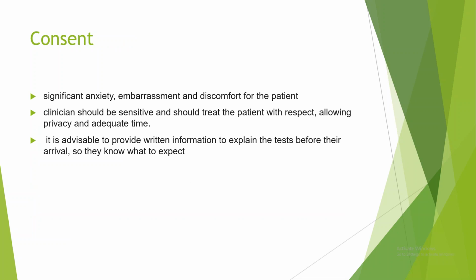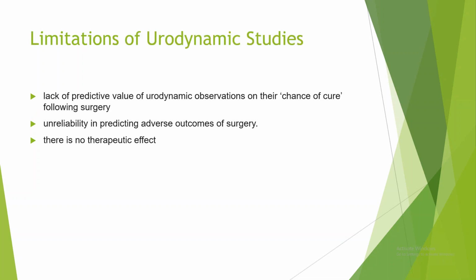Now in consent, the consent should be written. Actually, this urodynamic study causes very much embarrassment to the patient, and also it causes significant anxiety and discomfort for the patient. So for that matter, the clinician should be very sensitive and should treat the patient with respect and dignity, and should allow the patient privacy and adequate time. So the setting should be private, and the clinician should give adequate time to conduct the study. And if you provide an information leaflet before the urodynamics, at least the patient will know what to expect from the study. And in the consent, you have to explain the limitations also.